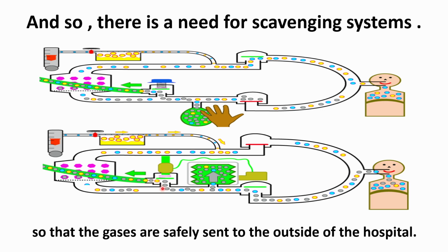Sometimes in some ventilators you have a pressure at this area of around 2 to 3, and this is applied by some machines in order to decrease the work of breathing on the patient. If you make the positive end expiratory pressure, the PEEP, zero, you can find in some machines that the PEEP is around 2 or 3. This is a mechanism inside this ventilator or this machine to help the patient open this valve without work of breathing.